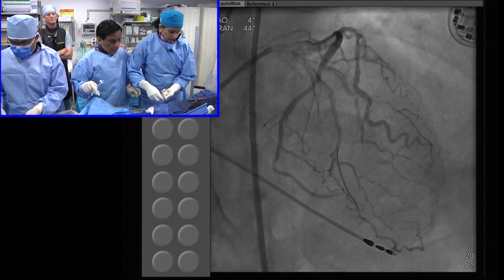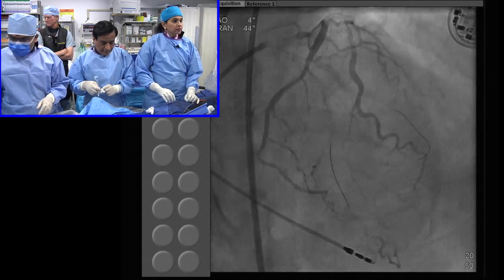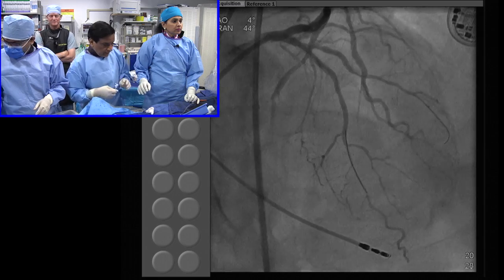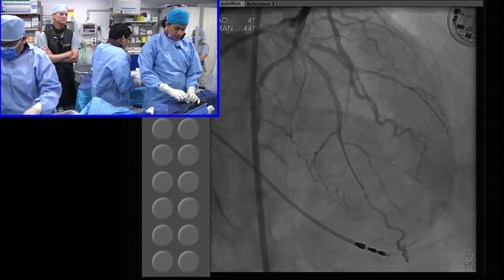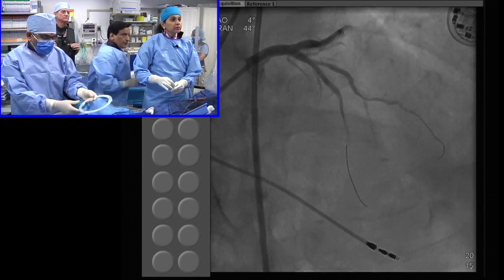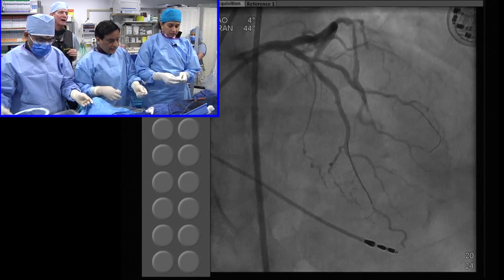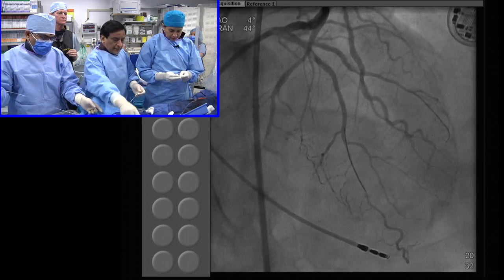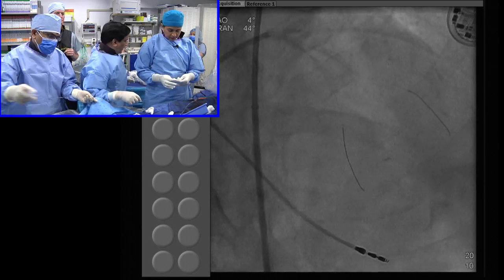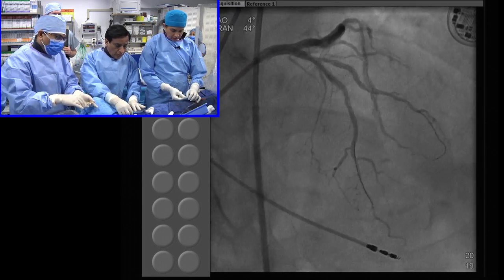Yes. So we'll try the 2.25 stent through the 2.5. So the distal edge. I think the lesion was longer, and we put only the 18 because there was a 2-segment lesion, and it created a little dissection at the level of that branch. The key is the same. We want to prepare it well. We want to take care of that because we try to avoid going through the struts.